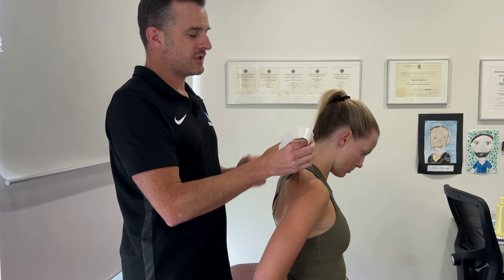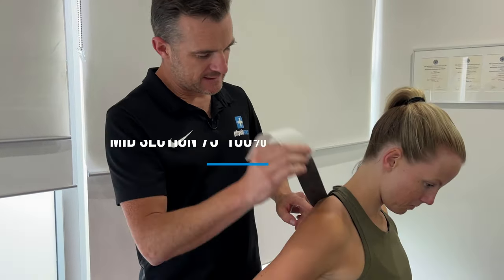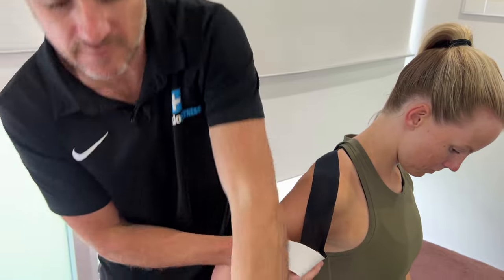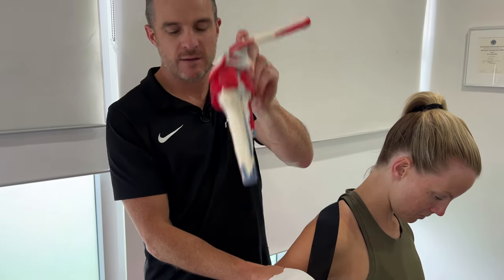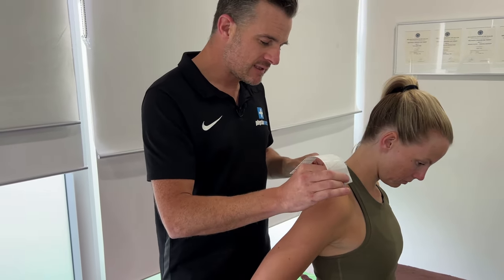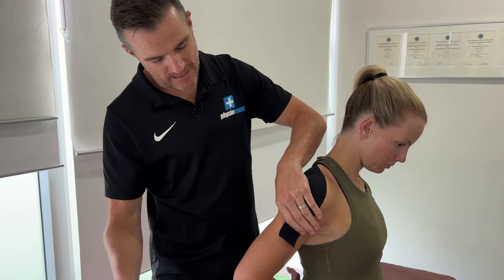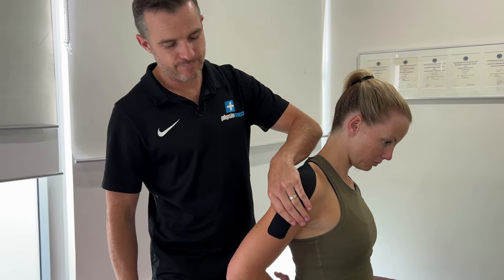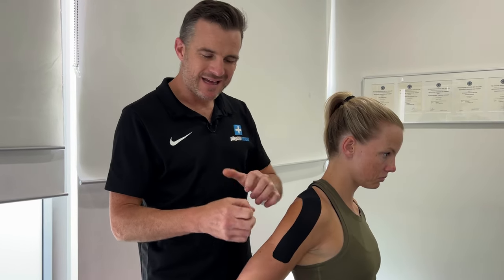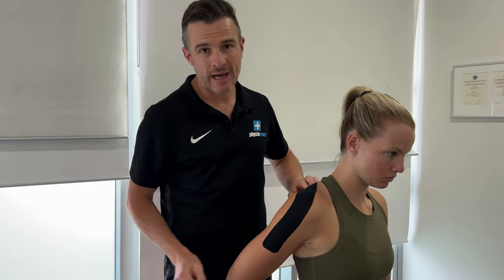From that anchor, the next section should be at 75 to 100% tension depending on how much activation you want. Make sure you don't pucker the skin — come right over the line of that muscle, over the front, almost over the AC joint or just a little posterior to that. Apply 75 to 100% stretch, then bring it down and onto the deltoid. That last bit is zero, just like the first, so there's no chance of it pulling off when she moves. That's your supraspinatus — you can do two layers if you like.